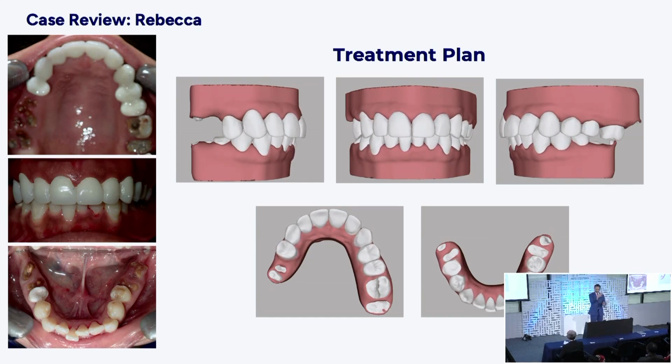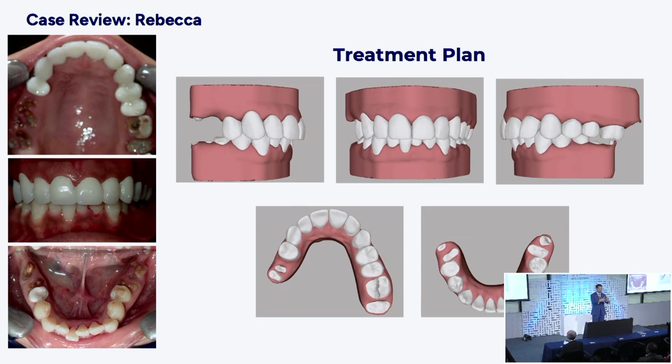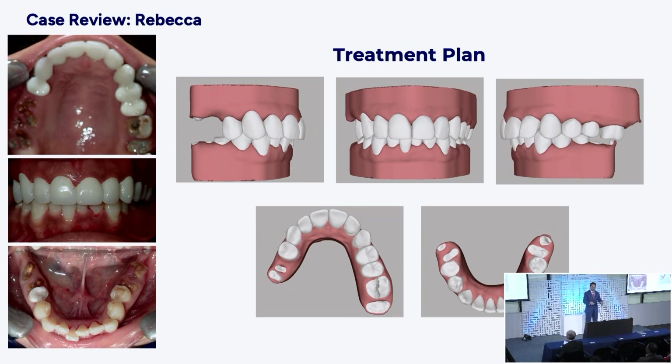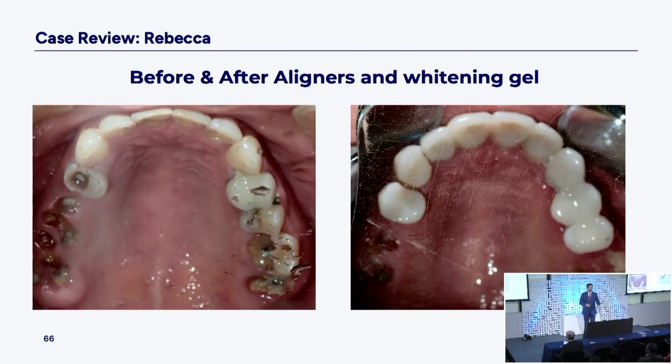I'm going to go in there and section my temp from the lingual so I can let those teeth spread out. Because to move premolar to premolar on the bottom, you're going to move premolar to premolar on the top. So we want to spread these teeth out nicely. Both have to move. So when the patient comes to get their aligners, we start to make sections in the temp. So now you can see just coming through the lingual, try to make some sections. It doesn't show that much from the front, but now they can move those.